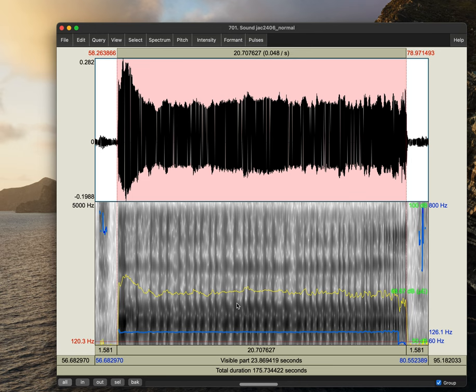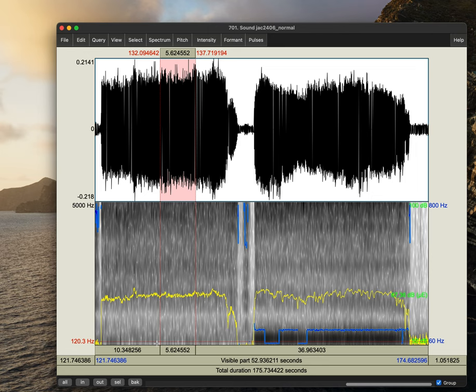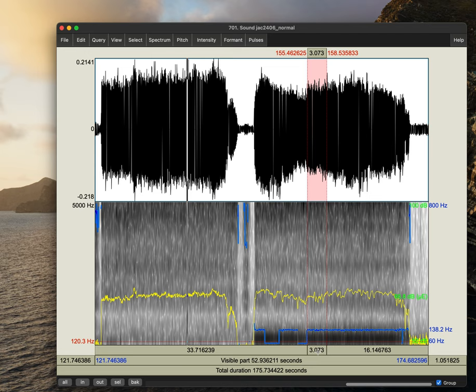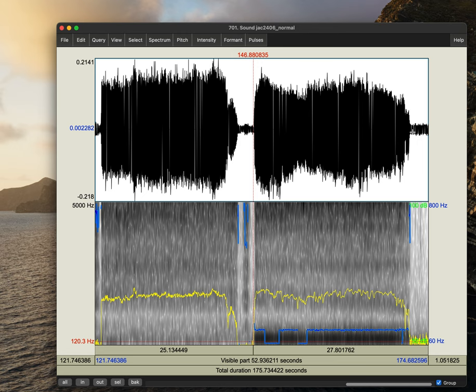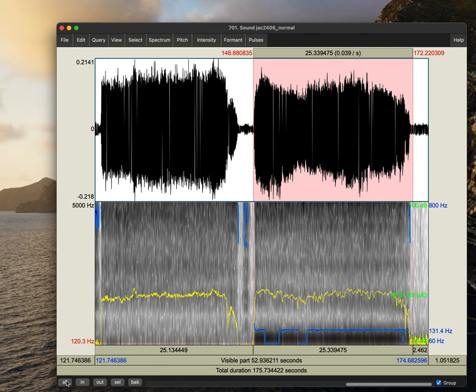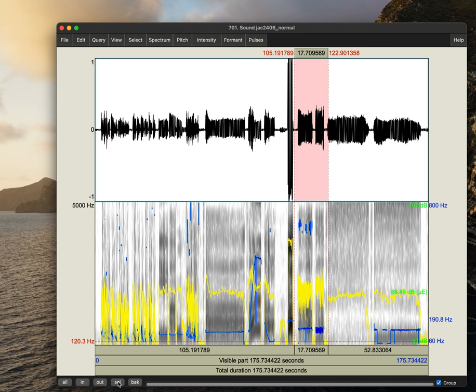If I wanted to look at S to Z ratio, I would do the same thing. I know S to Z ratio was completed at the end of this. I'll verify that this is S and that this is Z. Great. So to measure S to Z ratio, we can just find the durations here very quickly. 22.4 seconds and Z would be 25.3 seconds. And we would do our calculations for S to Z ratio from there.